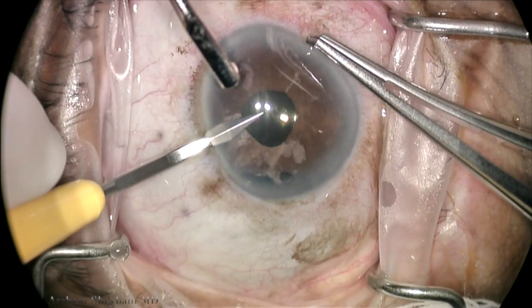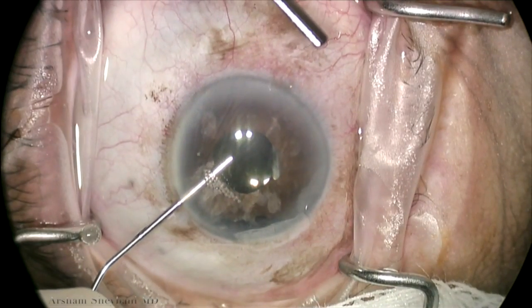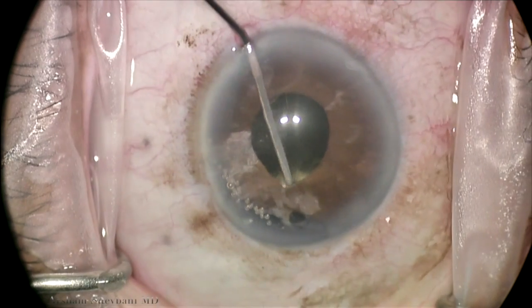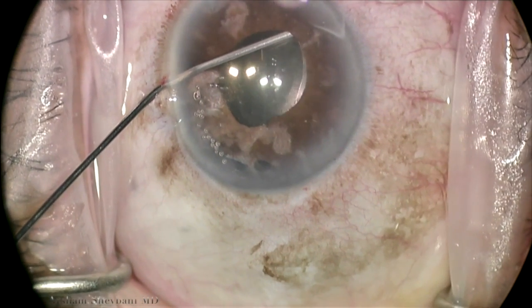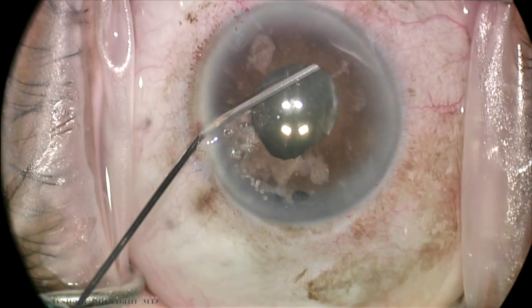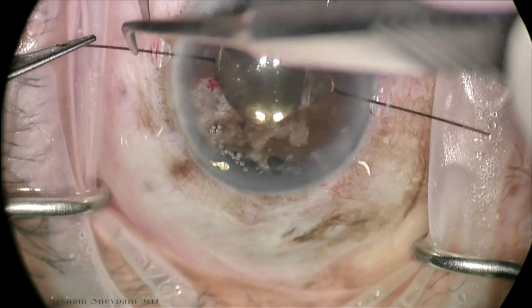This is a case of a patient with complicated cataract surgery and iris prolapse that had uveitis that could not be controlled without topical steroid therapy. The pressure is now rising, and this patient was actually sent in for glaucoma surgery. On ultrasound biomicroscopy, we actually found an area where the intraocular lens haptic was rubbing against the posterior iris. So our plan was essentially to either reposition or exchange this lens.